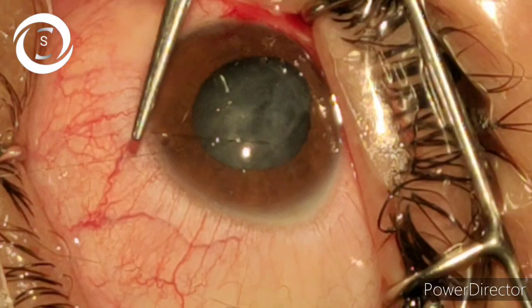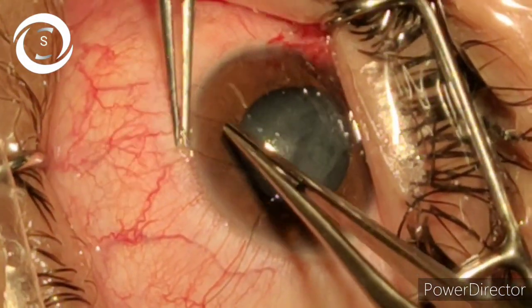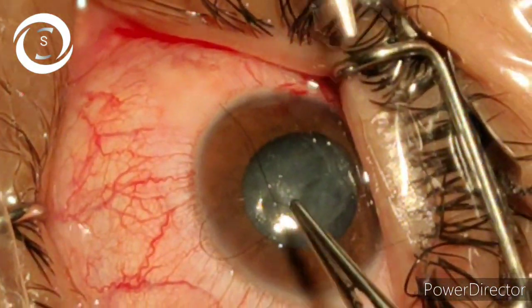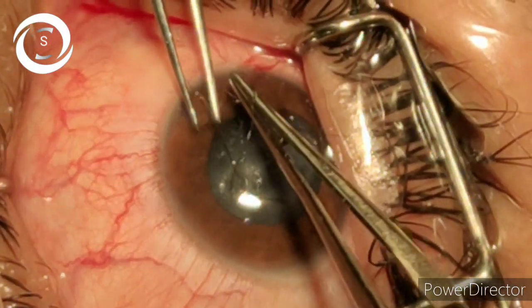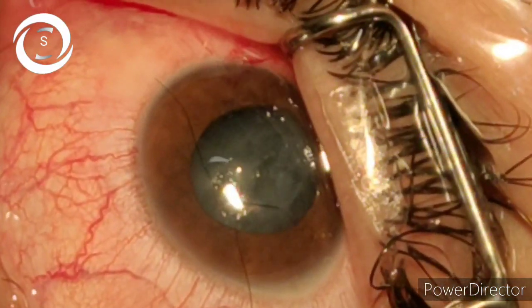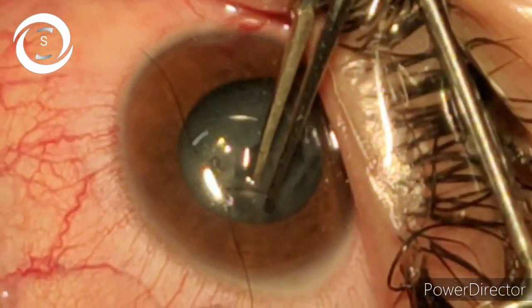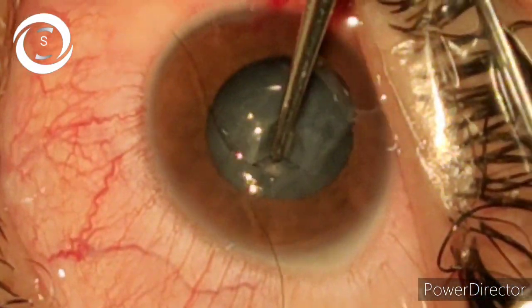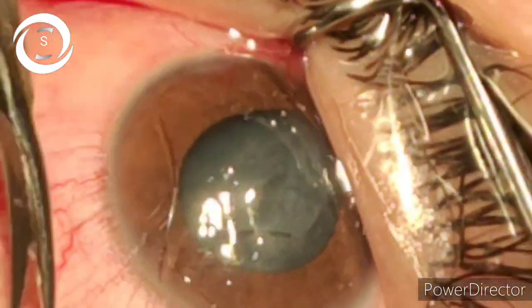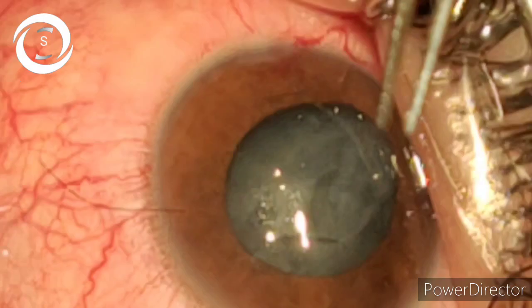You can see I am applying the knot. As it's a one-way locking knot, it should not be very tight and it should not be very loose. If you have to choose between tight and loose, at least it should be on the tighter side but not on the loose side. You should titrate its traction, and now I am burying it. I have buried the knots and now I will also bury the cut ends.